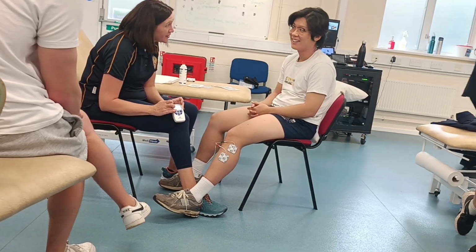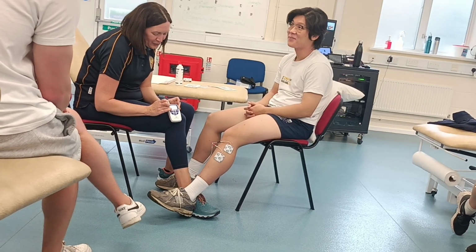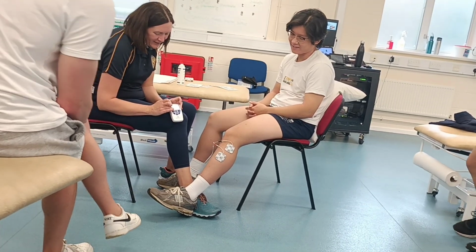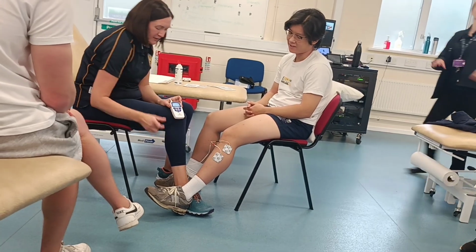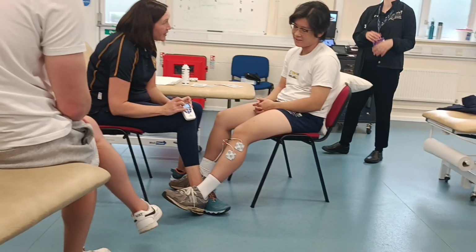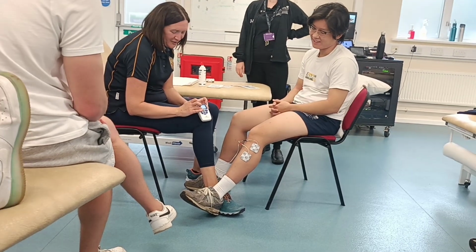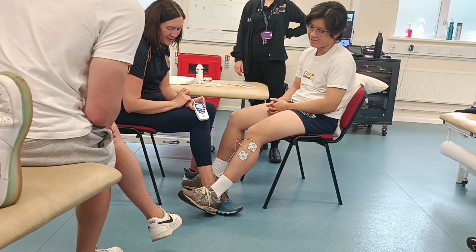You okay? It's not hurting you? No. You okay? It's only on quite low. It's still only on 25. And then it's going to go down again. I've got enough. We don't teach that one. You'd use it if you were working in sort of advanced neuropractice. There we go. Oh, lovely. Perfect. A few technical issues, but that's the movement that we're after. And then it's going to go down.